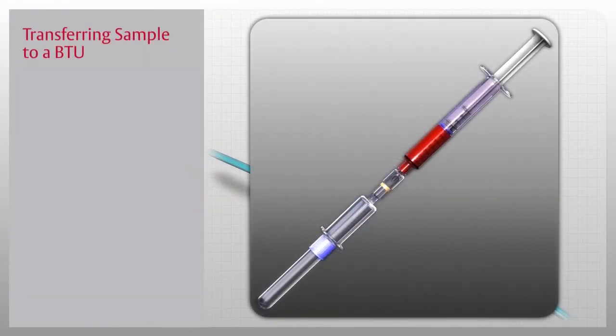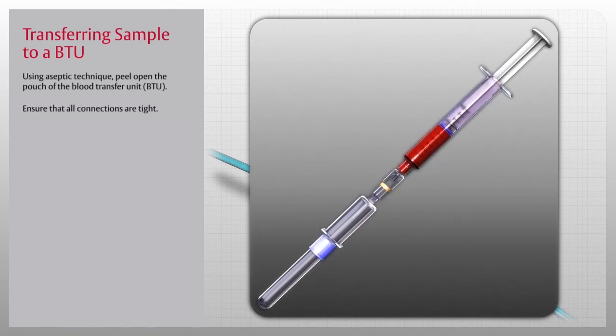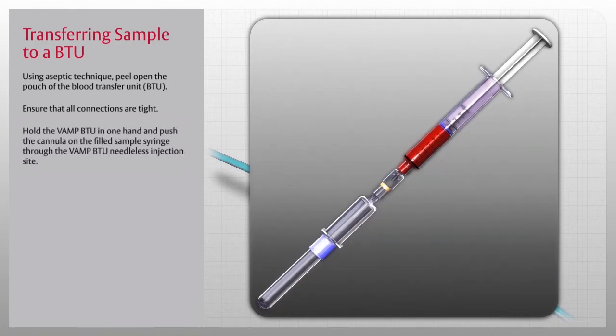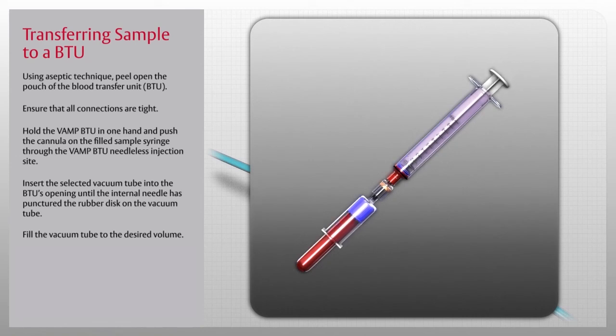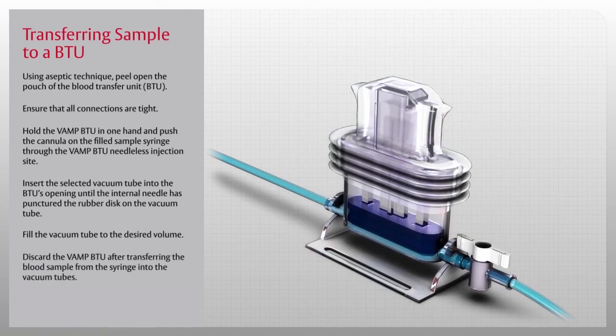To transfer the blood sample from the syringe to vacuum tubes, use the blood transfer unit, or BTU. Using aseptic technique, peel open the pouch of the BTU. Ensure that all connections are tight, hold the VAMP BTU in one hand, and push the cannula on the filled sample syringe through the VAMP BTU needleless injection site. Insert the selected vacuum tube into the BTU's opening until the internal needle has punctured the rubber disc on the vacuum tube. Fill the vacuum tube to the desired volume and repeat for all required tubes. Discard the VAMP BTU after use, and discard all syringes and cannulas after use according to hospital policy.